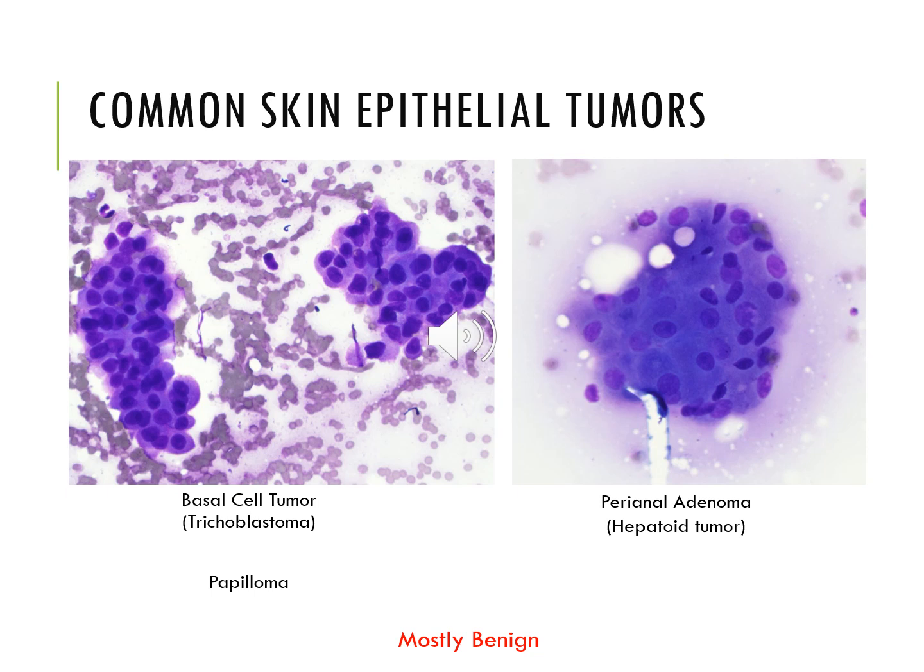We're unable to do that cytologically. And so, again, very minimal criteria of malignancy here. All the cells look fairly uniform, very minimal anisocytosis, anisokaryosis present.